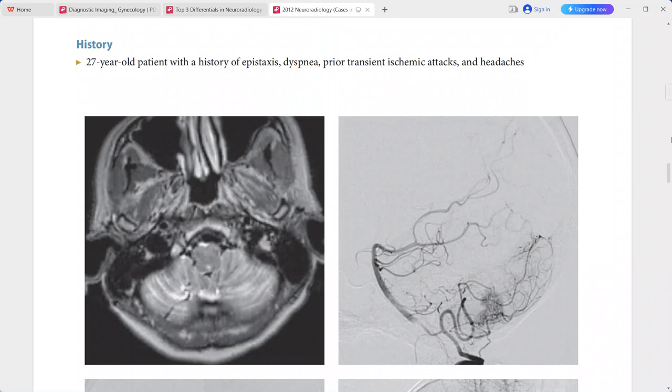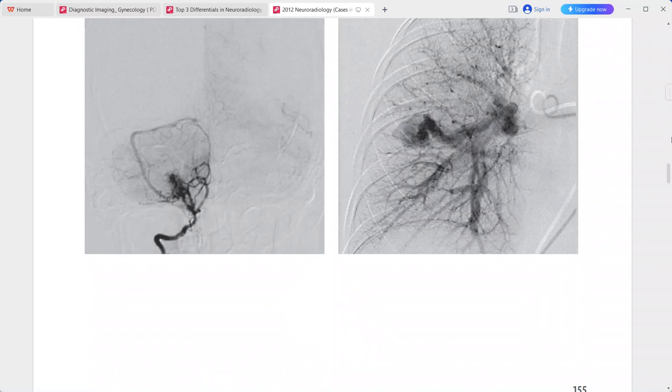This is a typical imaging presentation of Osler-Weber-Rendu syndrome, also known as hereditary hemorrhagic telangiectasia (HHT). Differentials include multiple intracranial malformations without HHT and multiple intracranial developmental venous anomalies such as venous angiomas.